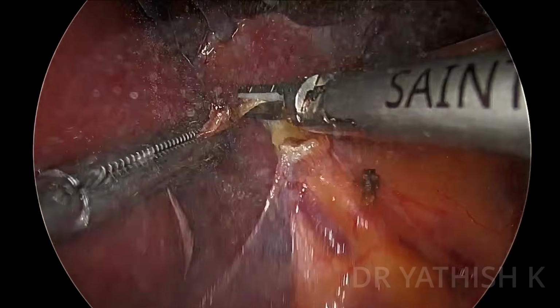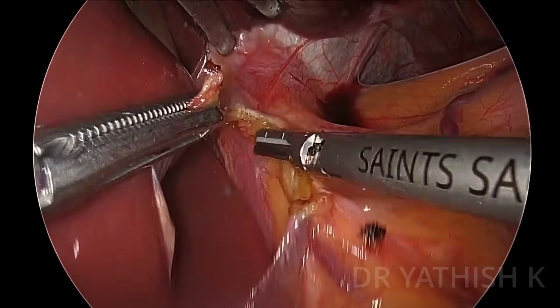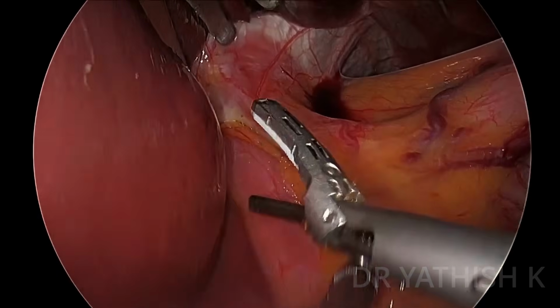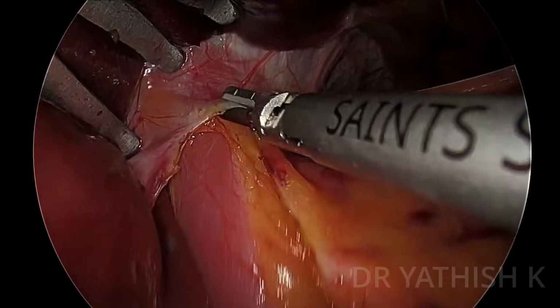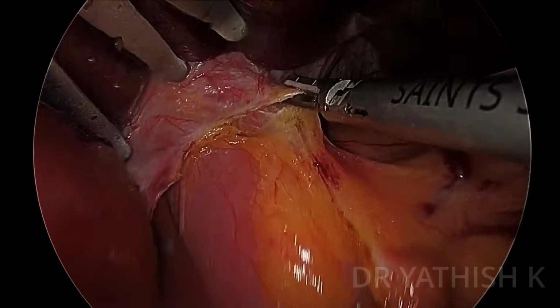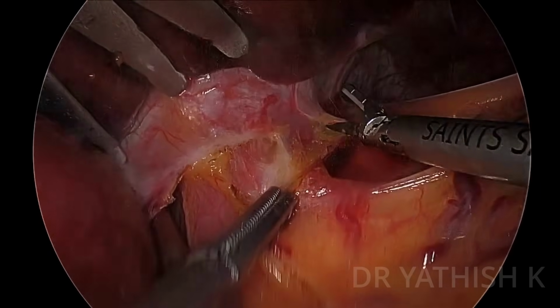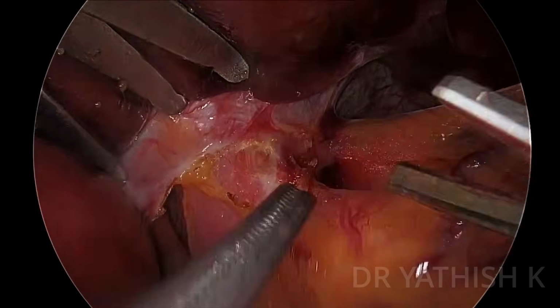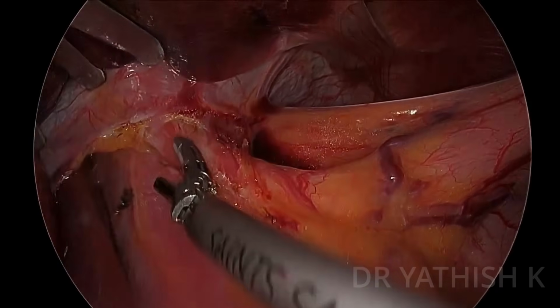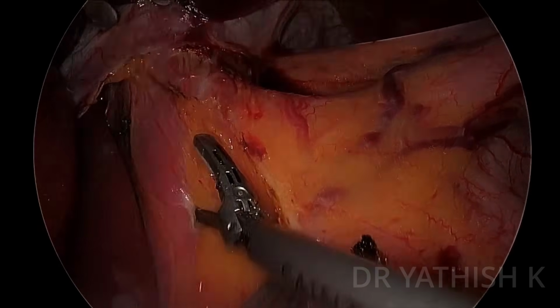The first thing is the pars flaccida approach, where the gastrohepatic ligament is opened carefully. This gives us access to the right crus and allows us to define the hiatal anatomy. Over there, I'm taking down the phrenoesophageal ligament as the right crus is already exposed. By taking down these phrenoesophageal fibers, you'll get exposure of the lower part of the distal esophagus.